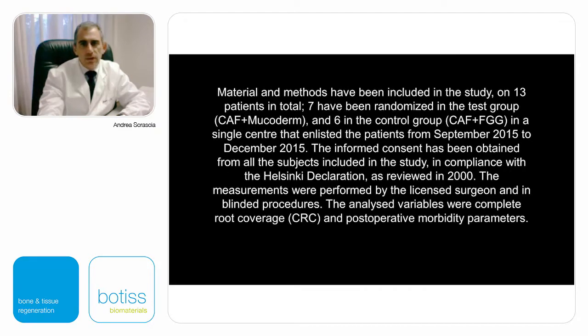The materials and methods: 13 patients in total were included in the study. 7 were randomized in the test group, CAF plus Mucoderm, and 6 in the control group, CAF plus free gingival graft.